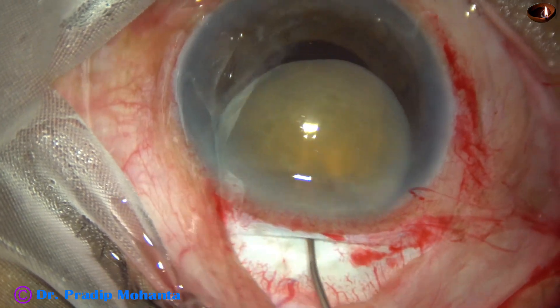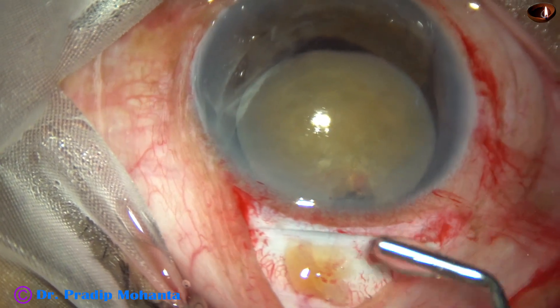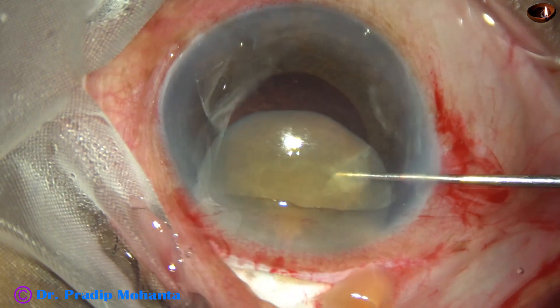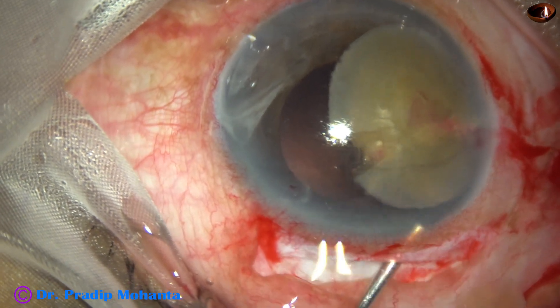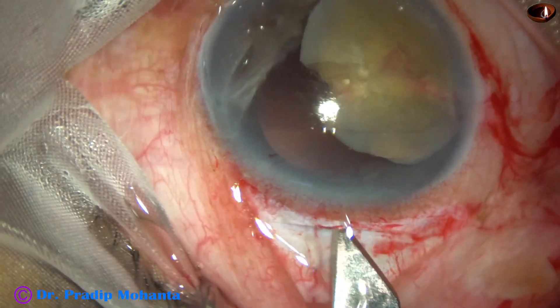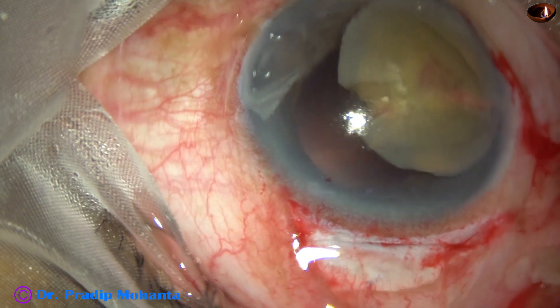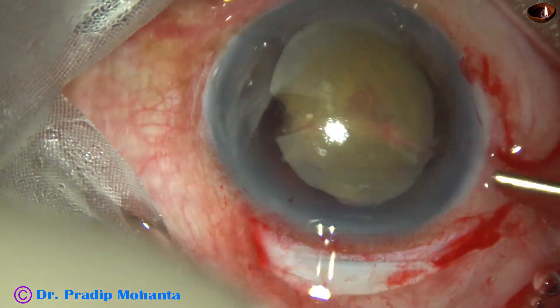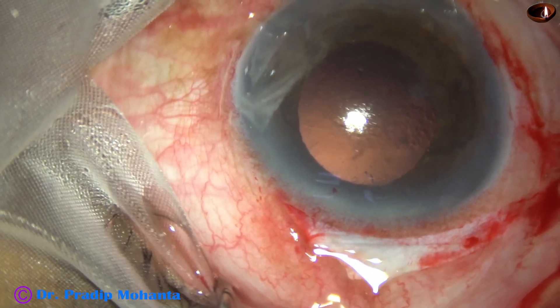I take help of a fish hook but it did not come out, so I have to enlarge the wound a bit. I try to push the nucleus out through the wound — it did not work. So I made one or two cuts on the right side of the wound, introduce the fish hook again, and this time the nucleus came out easily.